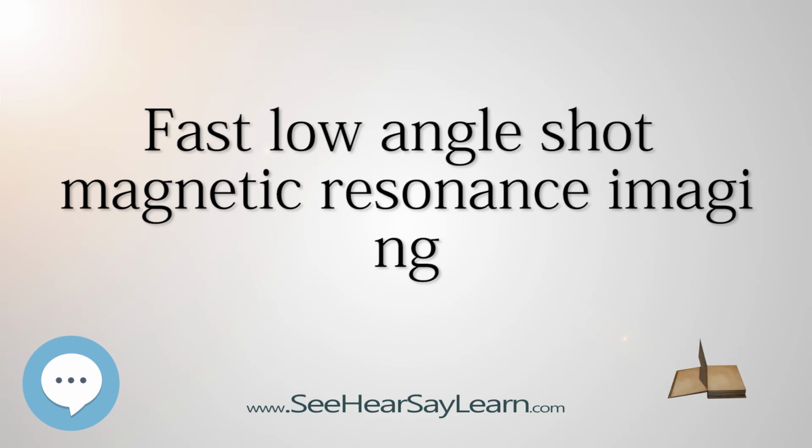In 2010, an extended FLASH method with highly undersampled radial data encoding and iterative image reconstruction achieved real-time MRI with a temporal resolution of 20 milliseconds, 1/50th of a second. Taken together, this latest development corresponds to an acceleration by a factor of 10,000 compared to the MRI situation before 1985. In general, FLASH denoted a breakthrough in clinical MRI that stimulated further technical as well as scientific developments up to date.